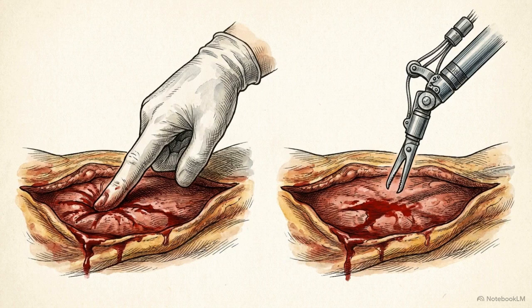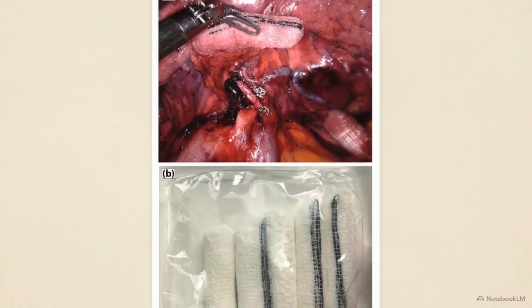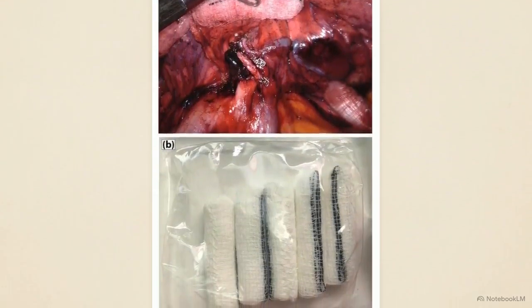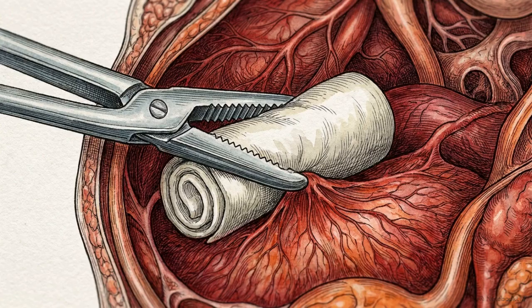In an open procedure, a surgeon can stop most bleeding with direct digital pressure. In MAS, the hands cannot reach the vessel. To compensate, surgeons use specific mechanical adjuncts. These include rolled swabs, specially designed to be inserted through a narrow port. Manipulated with robotic or laparoscopic graspers, these swabs provide a larger surface area for gentle retraction and localized pressure to control bleeding.